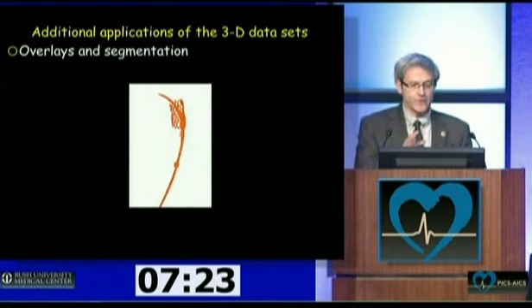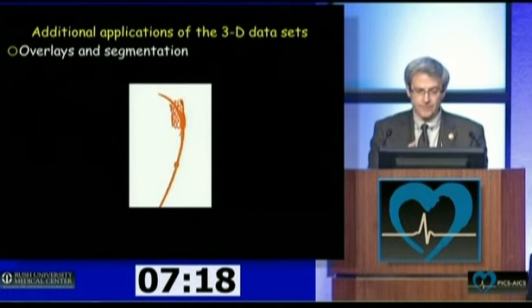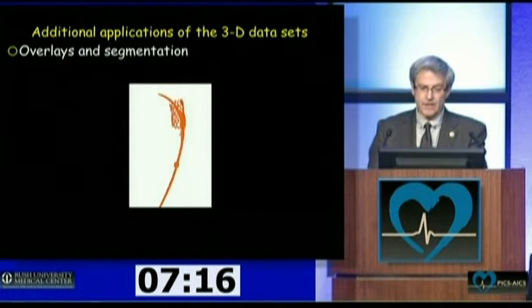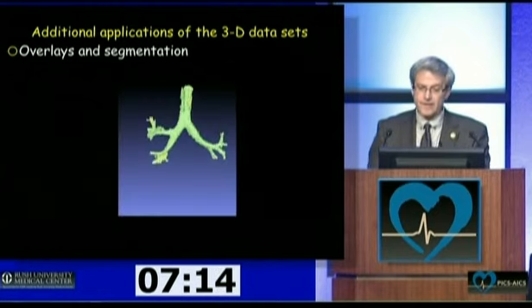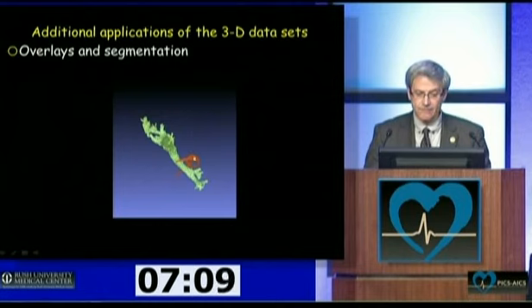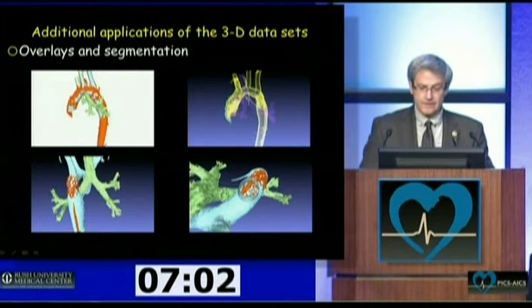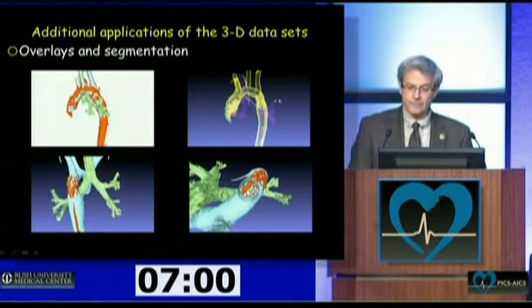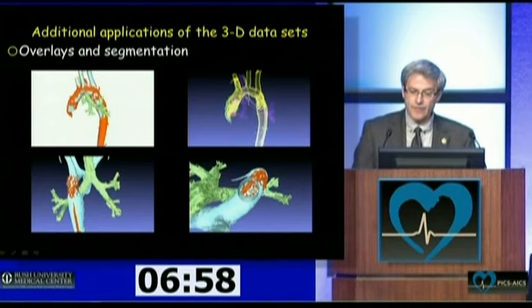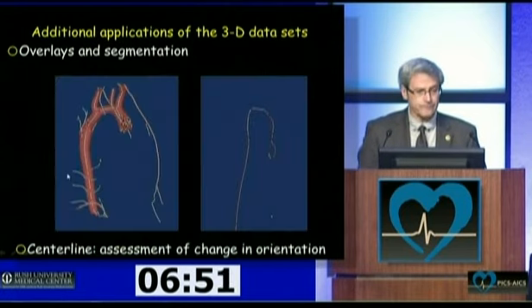And of course, we're always very interested in how the stents relate to other structures, so you can segment the images. This is the stent and the catheter through it. That's the trachea, obviously. So you can put them together and get an idea of how the stent relates to the bronchus, or you can use different segmenting algorithms and see how these three-dimensional structures relate, or what you're actually doing three-dimensionally to the patient's anatomy.